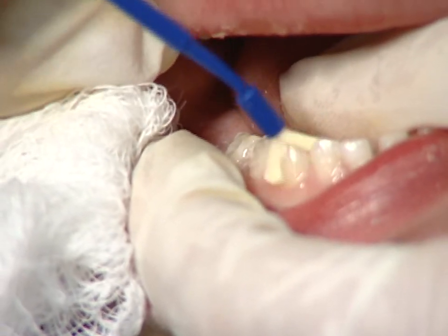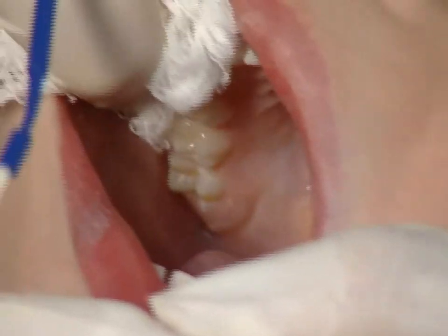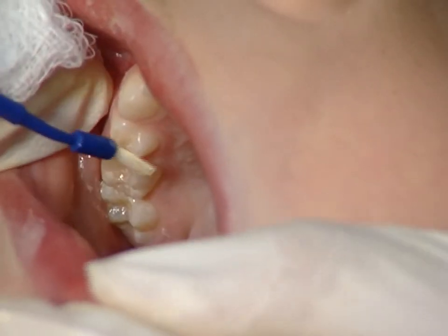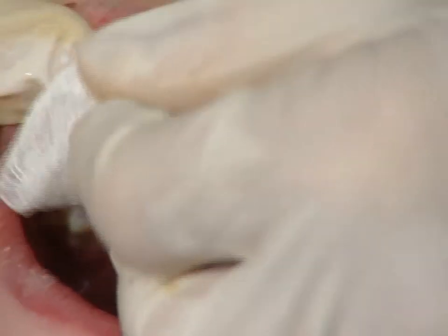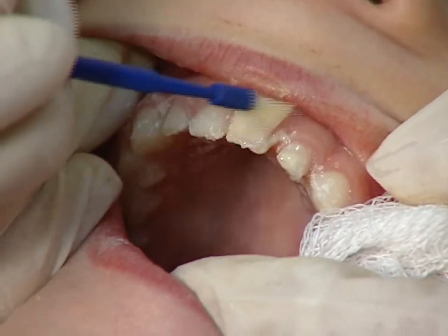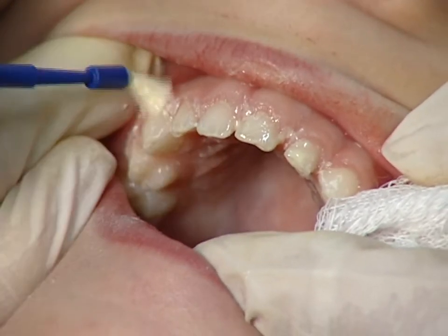Frequently, we do not do the lower incisors as they rarely get cavities. As you paint on the varnish, make sure you cover all the tooth surfaces. Once the varnish is on, you do not have to worry if it gets wet as it sets on contact with saliva. Paint the upper incisors last so that you do not accidentally wipe off the fluoride varnish as you work in the back of the mouth.